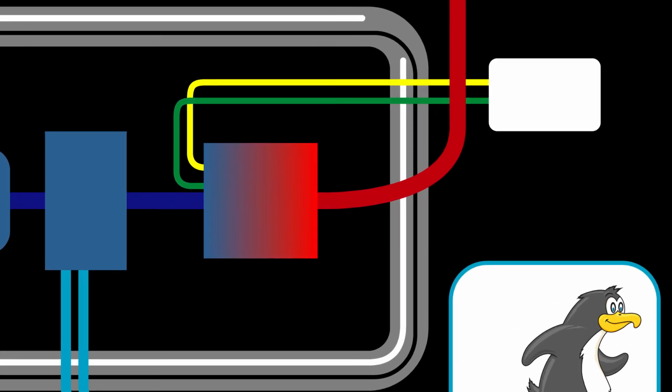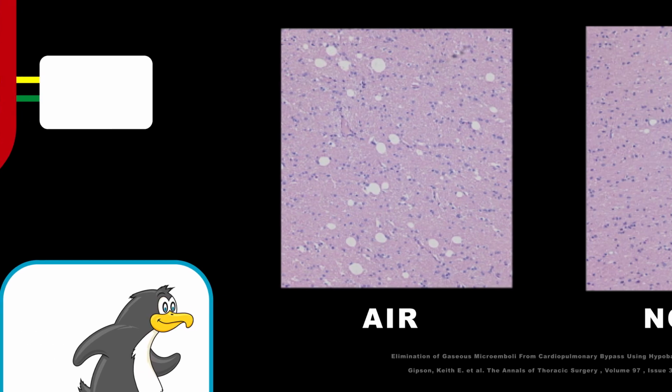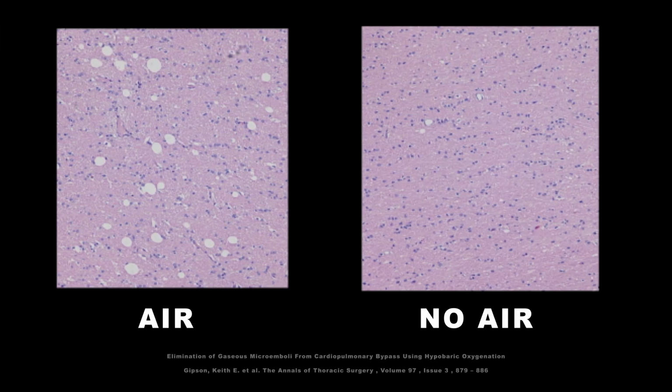EDAC studies demonstrate how GME are removed as they pass through a denitrogenated circuit. The choice? Do you want air or no air in your brain? This technique avoids complications associated with GME, better patient outcomes.